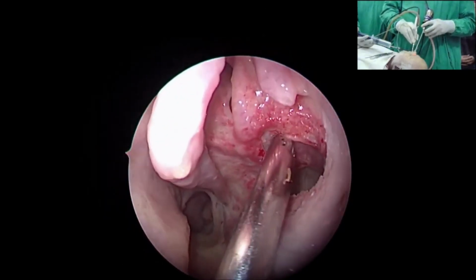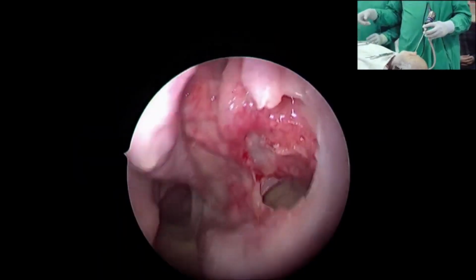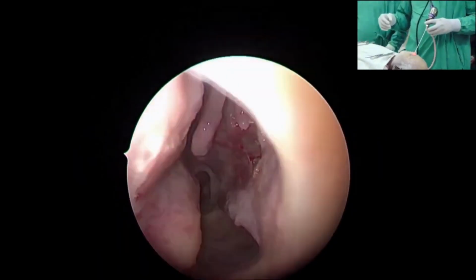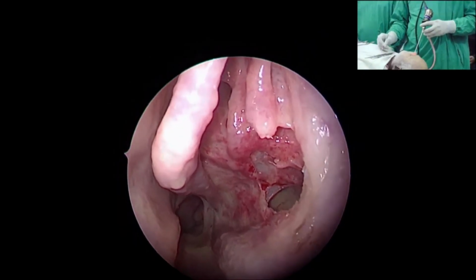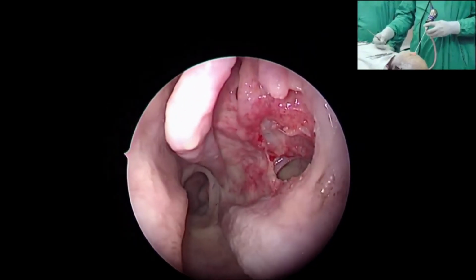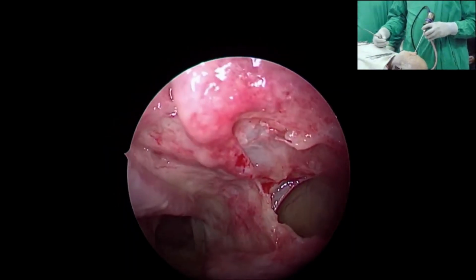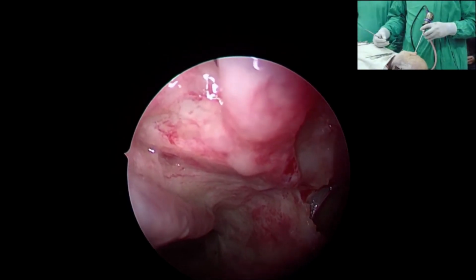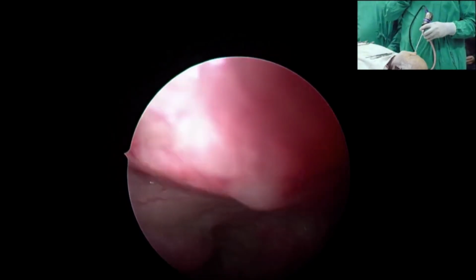But the most important thing, I think, as what Satish has showed beautifully, is we need to preserve the mucosa all around the maxillary ostia. There's no point making a large opening if the mucosa is damaged and the mucociliary clearance is gone. One of the commonest mistakes that people do is they make a very large opening, but in the process of doing so, the mucociliary clearance is damaged because all the mucosa circumferentially along the maxillary sinus is damaged as well.